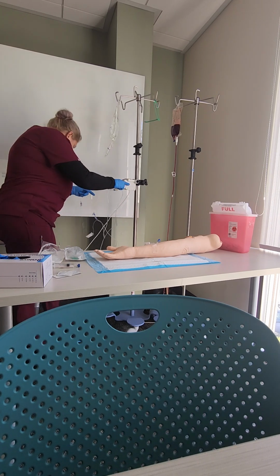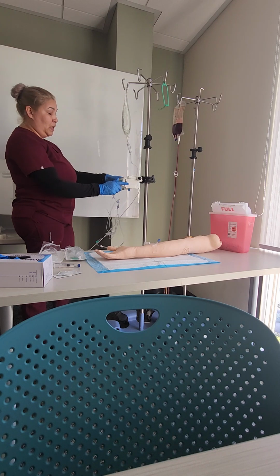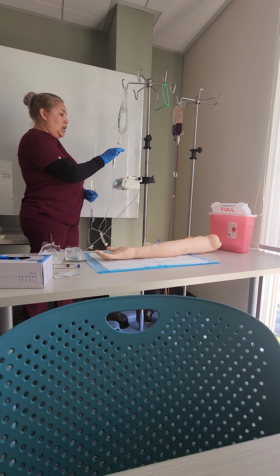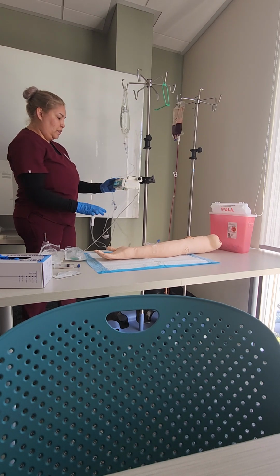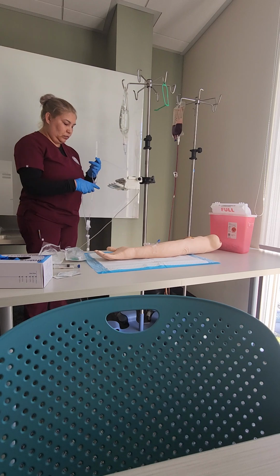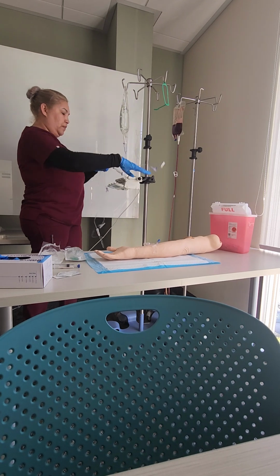I want to open the machine. First, I have to make sure it's on. So I am turning on the machine. And while the machine is going, I can start by filling up my chamber. Okay. I want to open up the machine. Okay. So what I want to do now is work from right to left.